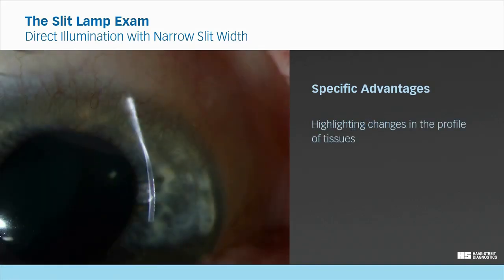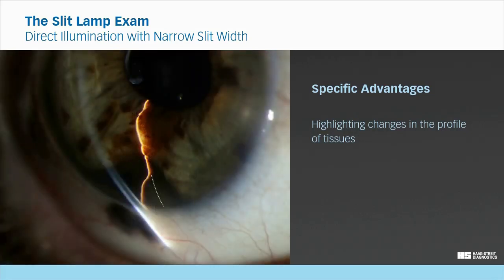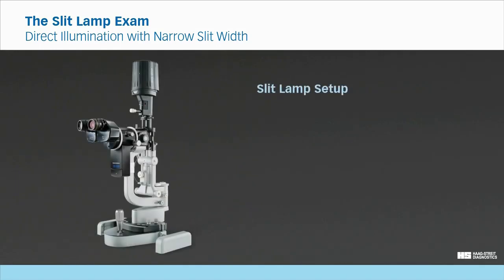Another particular advantage of using a fine slit illumination is that it allows for the observation of changes in the profile and the thickness of tissues. In this case, for example, the slit beam reveals the thinning of the cornea. Or in this case, the reflection of the slit on the iris shows how its contour is affected by the melanoma.